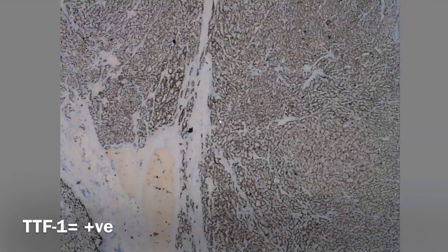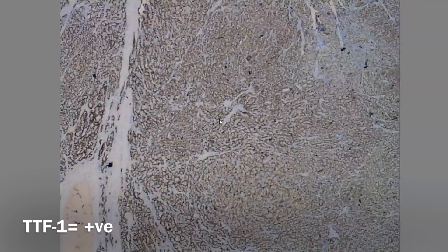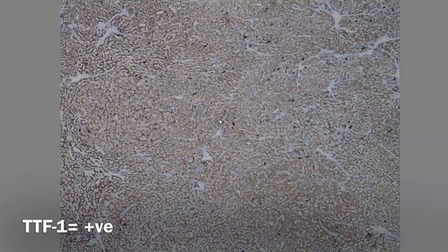We also have TTF1, which is sometimes positive in neuroendocrine tumors, and here it is positive. We also performed p63 staining to differentiate and exclude squamous cell carcinoma. P63 is negative here — if it were positive, we could consider squamous cell carcinoma — but here all the tumor cells are negative.